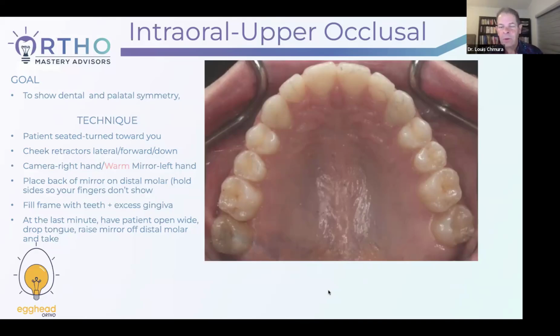So what do we do? How do we do that? Have the patient seated in the dental chair. I've done all those other ones, and I'm coming on doing these. We're going to put both the lip stretchers in, show them how to hold them forward a little bit, right? Then I take the mirror, I've got it warmed up, I take it out, either dry it if I warmed it up in the sink, or just pull it out of the warmer.